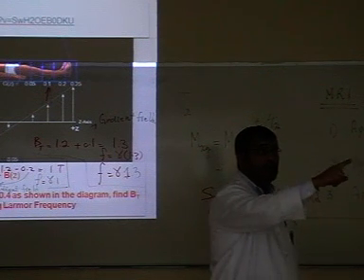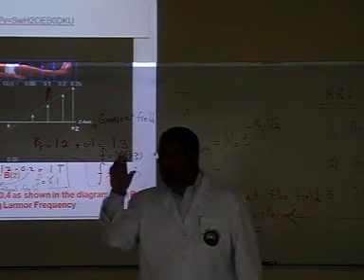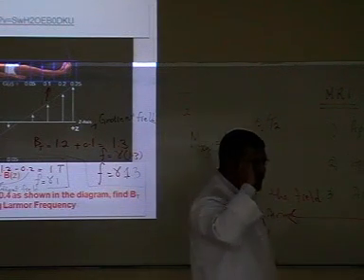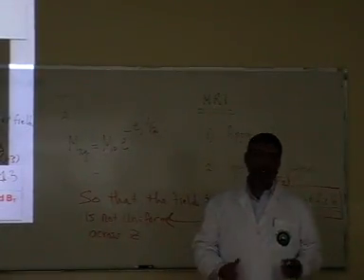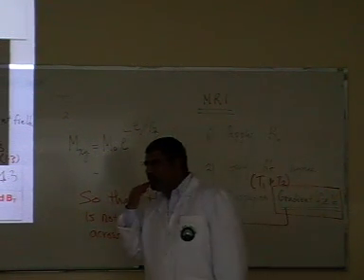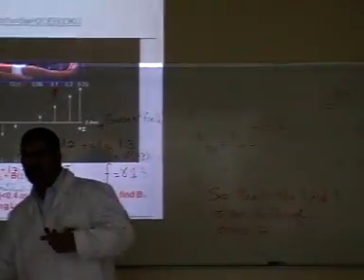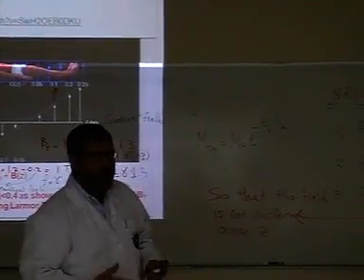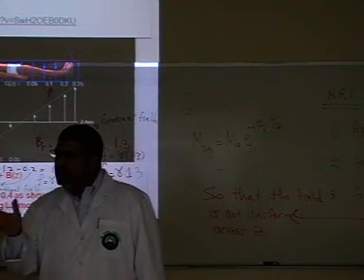Shielding? Metallic, yes, because you're dealing with magnetism. The main thing you have to worry about is that this magnet is huge, and you want to make sure that your patients do not have any implants, metallic tooth fillings, or braces, things like that. But in terms of ionization, do we have any?